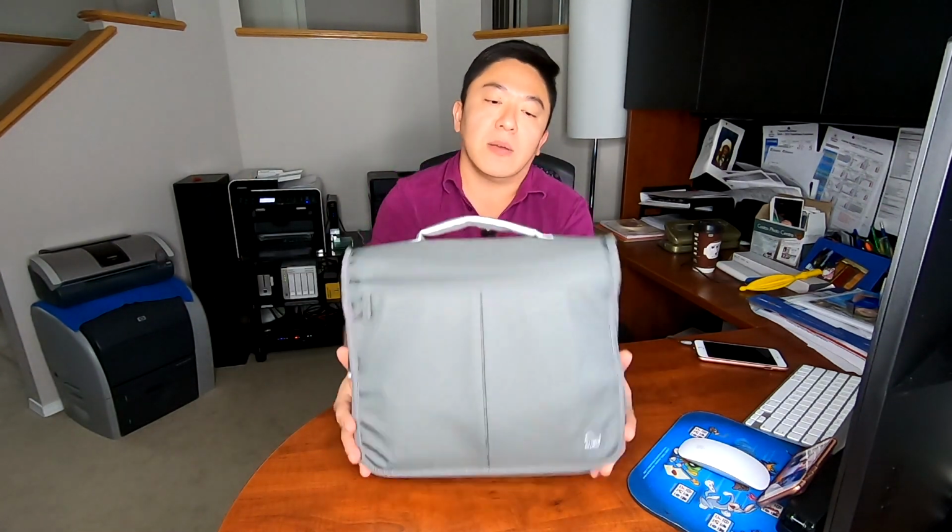As I mentioned earlier, CPAP treatment is the gold standard in obstructive sleep apnea treatment. This unit I have before me is a ResMed AirSense 10 AutoSet for Her CPAP machine. Now you guys are wondering, why did I get a for-her machine? And it's really simple actually. It's because this machine costs exactly the same as a non-for-her version, but offers you one additional algorithm above and beyond all the other units.